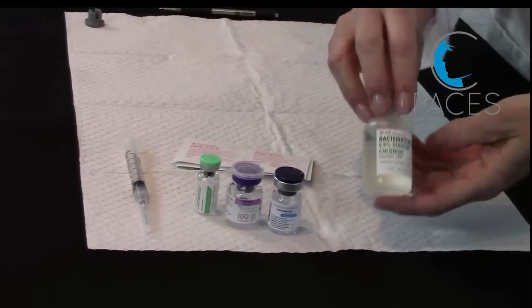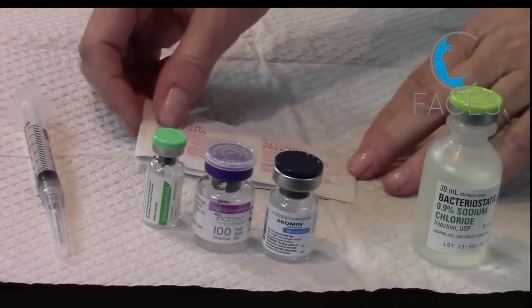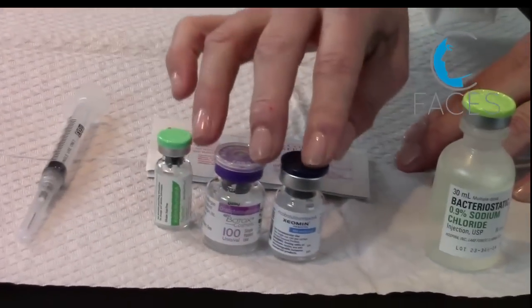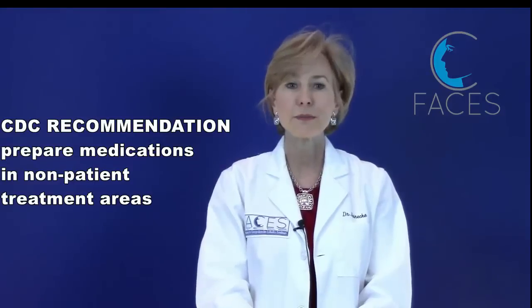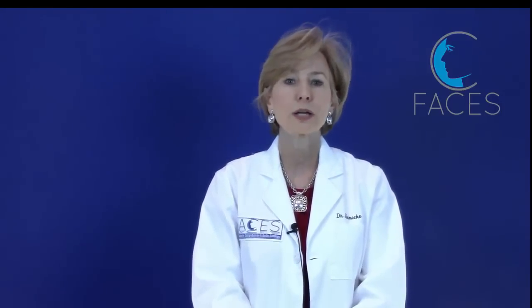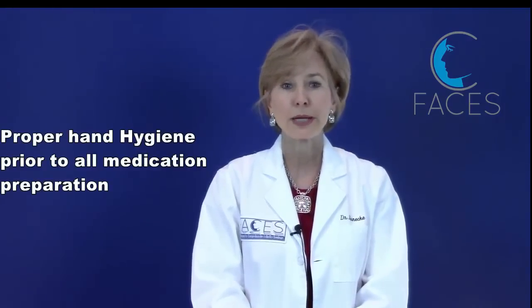Here's what you're going to need for reconstitution: bacteriostatic saline, 70% alcohol wipes, a sterile needle and syringe (3 cc's), and of course your neurotoxins. The CDC recommends that any medication preparation takes place in a designated clean medication area that's away from areas where potentially contaminated items are placed. Any item that could have come in contact with blood or body fluids shouldn't be in the medication preparation area, and proper hand hygiene should be performed prior to handling any medications.